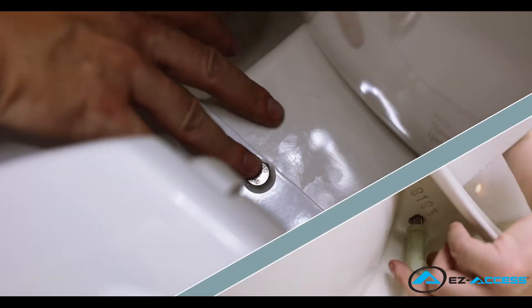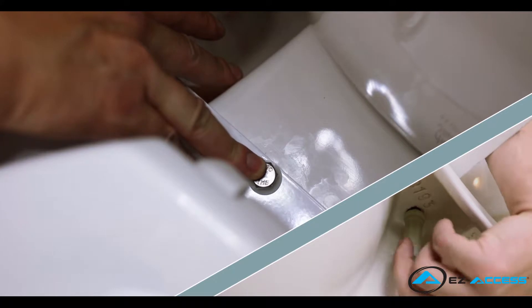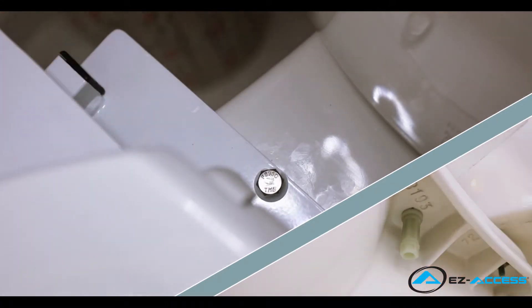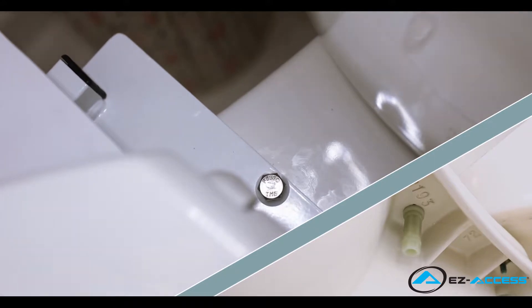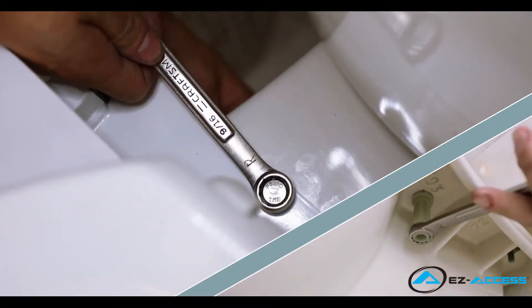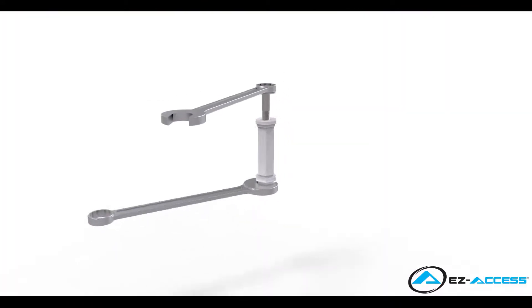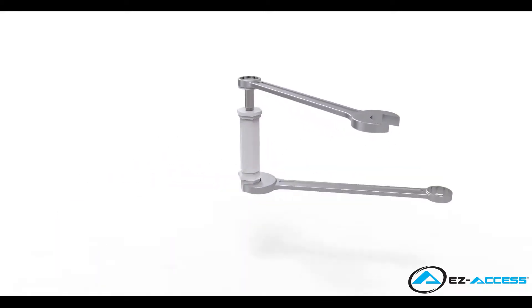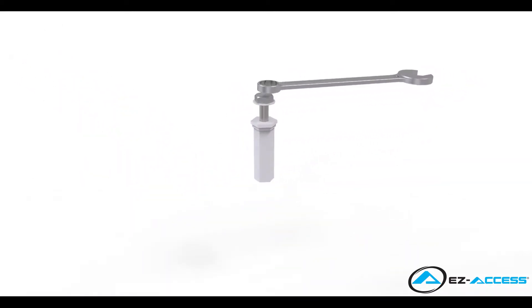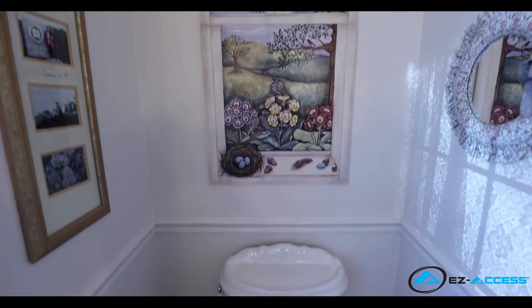Hold the top of the bolt in place. Attach the plastic tower nut to the bottom side of the bolt and finger tighten until snug. Repeat this process for the second hole. Using the 9/16 inch wrench, tighten each bolt on the top while simultaneously tightening the plastic tower nut completely by tightening the snap nut on the bottom using the 5/8 inch wrench. The snap nuts will snap off the plastic tower nuts once the proper tightening is reached.